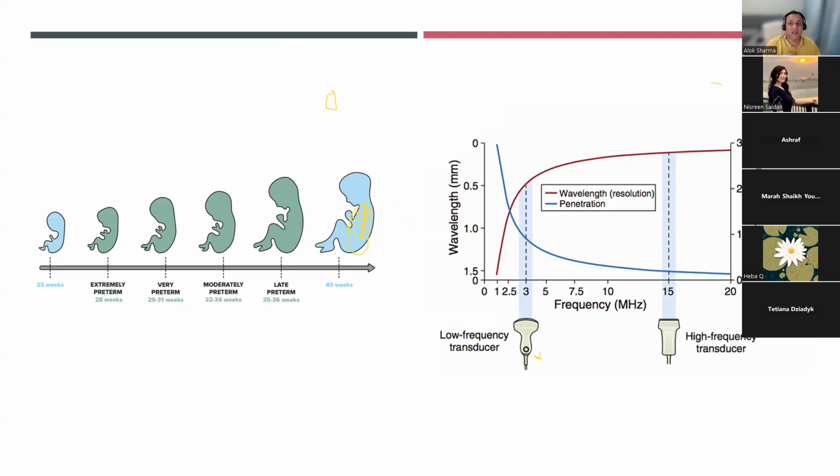Can you imagine how much handling that is? Can you imagine how much ultrasound that's basically putting into a baby's lungs? Now, just be aware there are animal studies that show that you can actually cause pulmonary capillary hemorrhage. So we want to restrict the amount of handling.